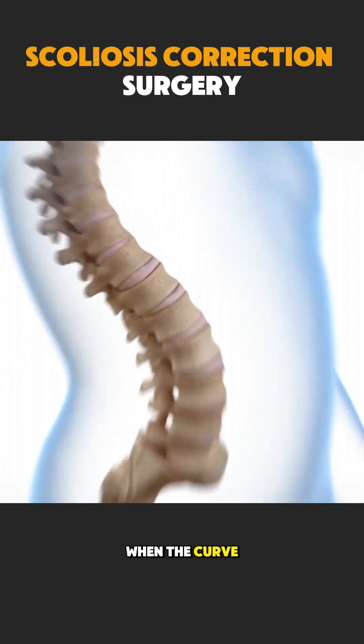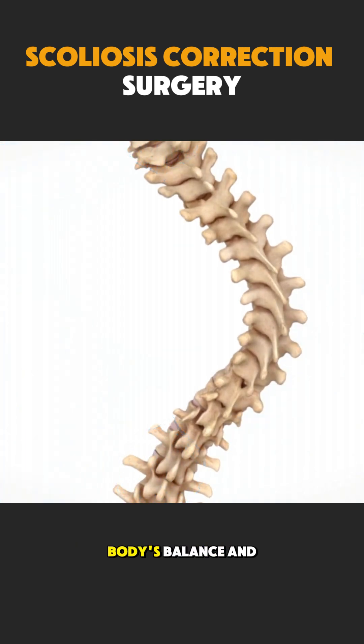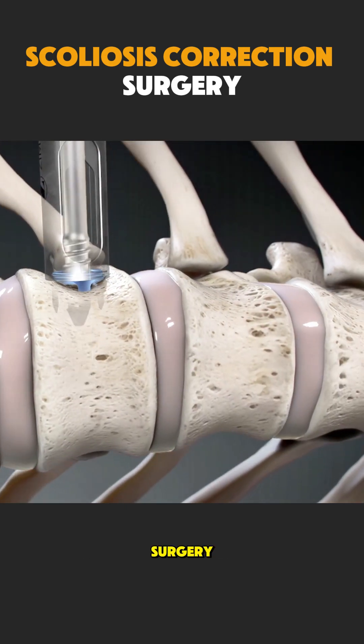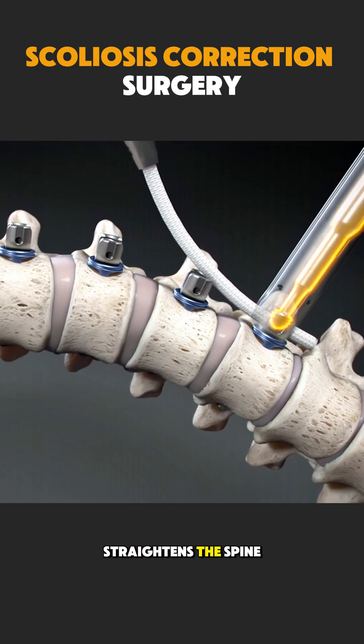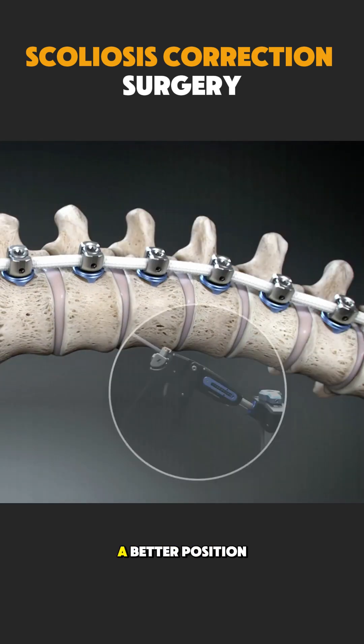When the curve becomes severe or keeps worsening, doctors recommend surgery to protect the body's balance and function. During scoliosis correction surgery, the surgeon carefully straightens the spine and uses metal rods, screws, or wires to hold it in a better position.